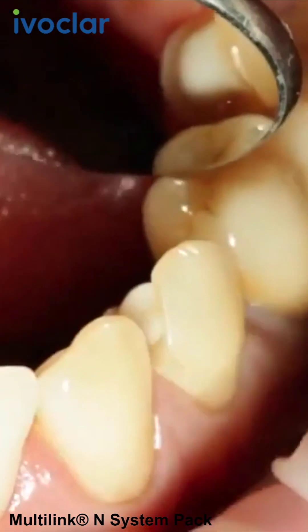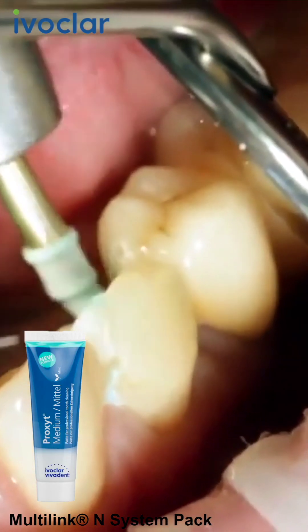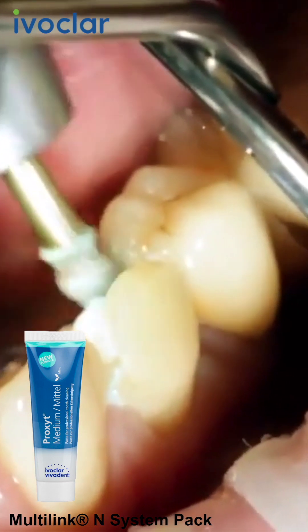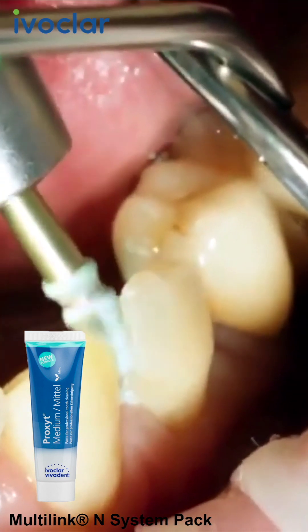Remove the temporary. If necessary, clean the preparation with a polishing brush and a fluoride-free cleaning paste, such as Proxite Fluoride Free, in order to remove any leftover temporary cement.